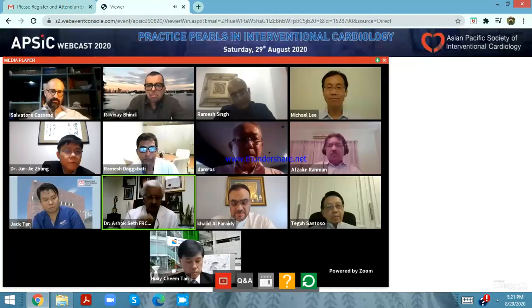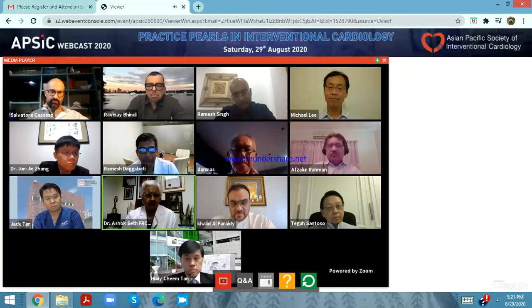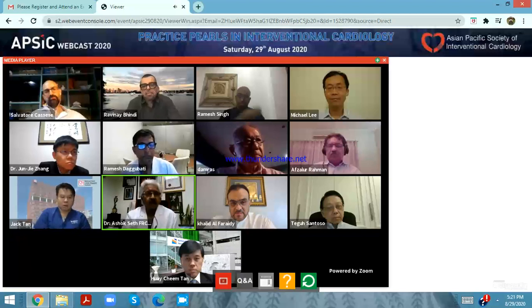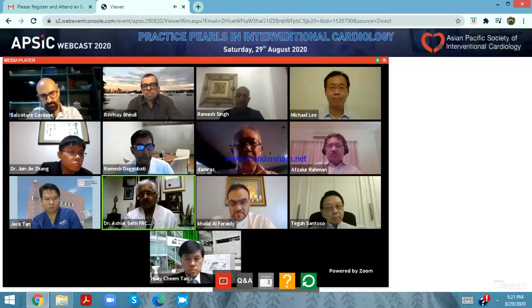Because we've got a good experience of shockwave as well as ultra high pressure. We've had ruptures of the IVL. When it ruptures during the pulses, it's usually when you've already delivered 60, 70 pulses, and it's towards the end in a very heavily calcified lesion that it does rupture. But if it ruptures during pulses, it does create extensive dissection.